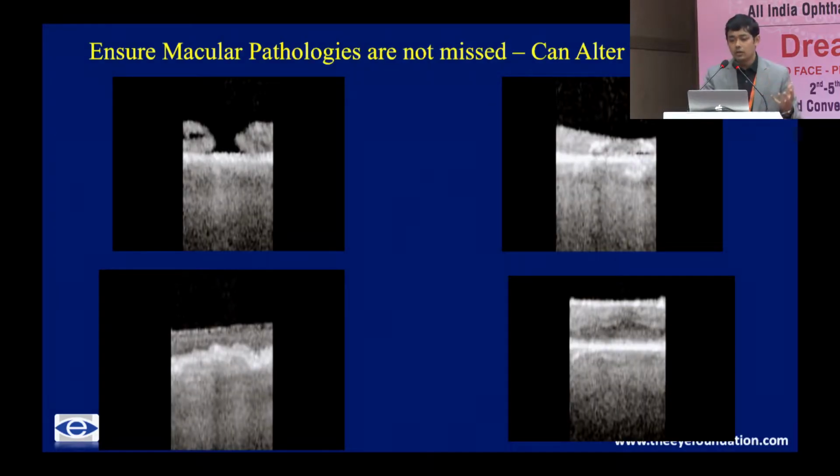It also alters your workflow. If you detect any basic macular pathologies, that can also be detected.